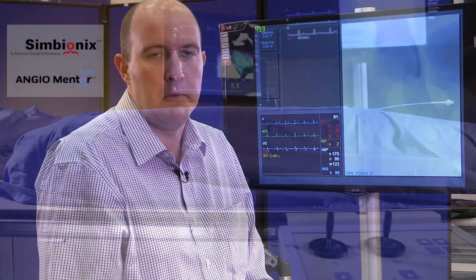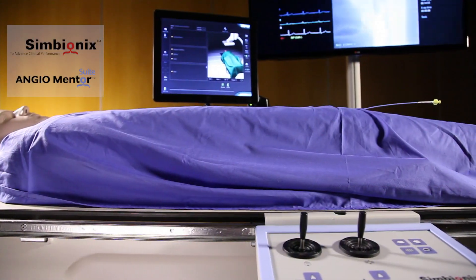Hello there, my name is Mr Philip Davie. I'm a consultant vascular and endovascular surgeon at the University Hospital of North Durham, and this afternoon we're going to do an SFA angioplasty on a symptomatic patient.